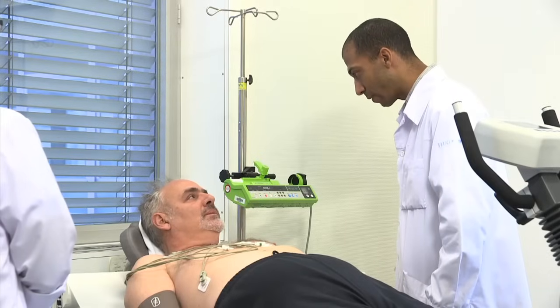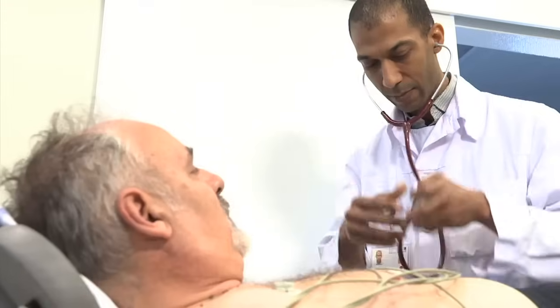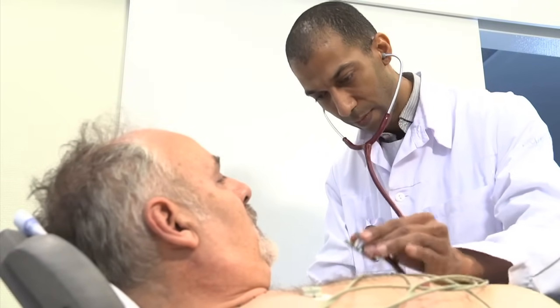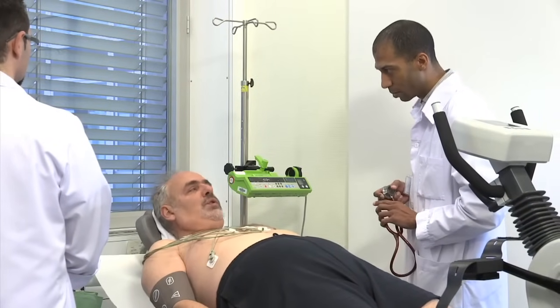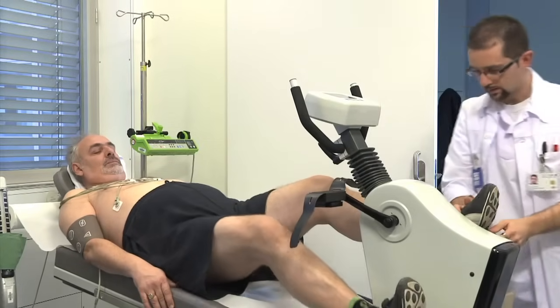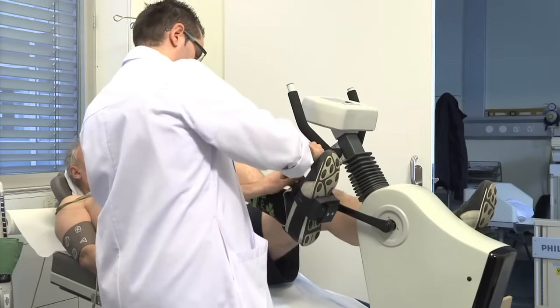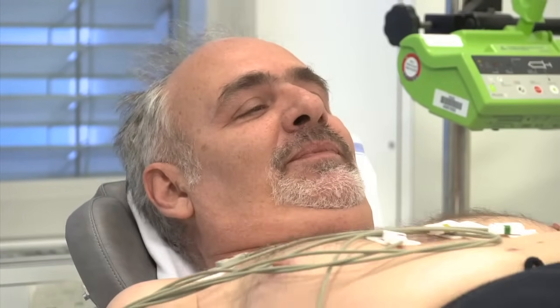L'examen se déroule en trois parties : un test d'effort, la réalisation d'une première série d'images montrant le cœur en situation de stress, puis une autre série d'images au repos. Le test d'effort peut s'effectuer de deux façons différentes : soit le patient pédale et fournit un effort important, soit le patient ne peut pas pédaler et dans ce cas, un médicament est utilisé pour mettre son cœur en état de stress.